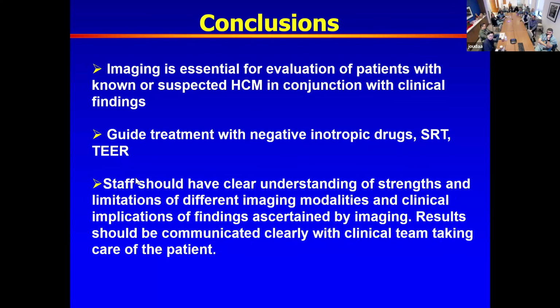We have a question from Sandra, who's one of our frequent attendees. It's also one of the questions we often encounter in our lab. If your patient has a baseline or rest gradient of more than 50 millimeters mercury peak, do you still instruct patients for Valsalva, or what's your protocol? We do both. Yes, even with a 50, I would go for a gradient with Valsalva. And the reason is both are targets for treatment, for example, with myosin inhibitors or with septal reduction therapy.